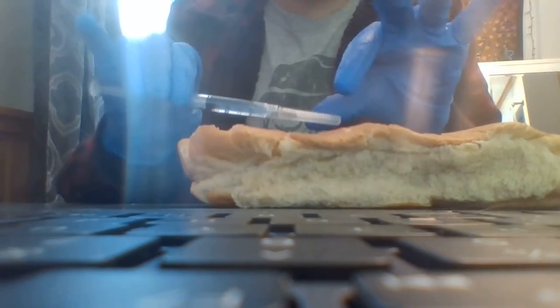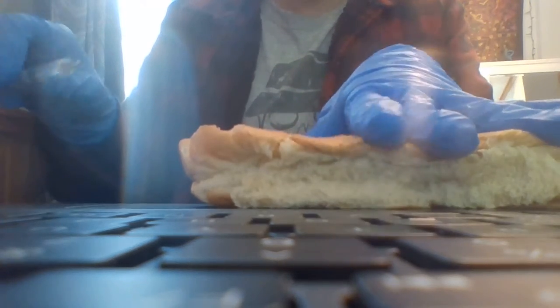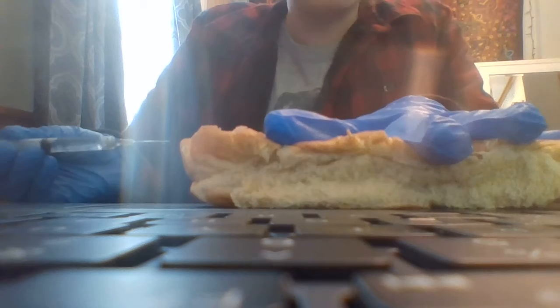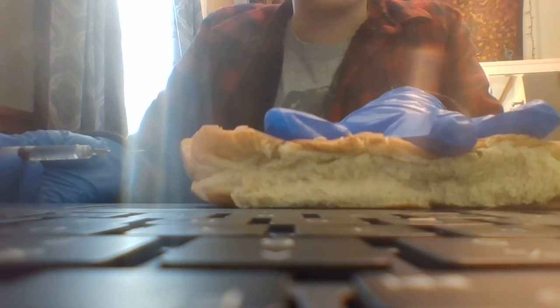Before I do that, obviously, I needed to take off my cap. Now I'm going to hold the skin taut. I'm going to be administering this medication at 90 degrees into the muscular layer of the skin.